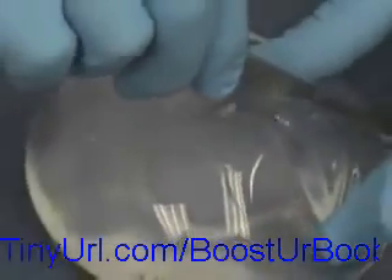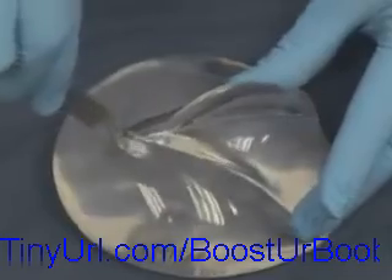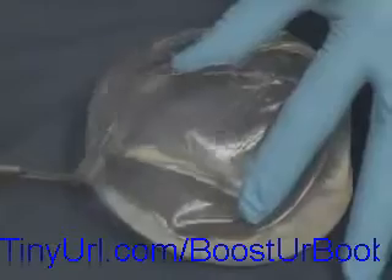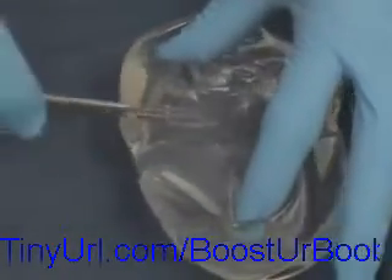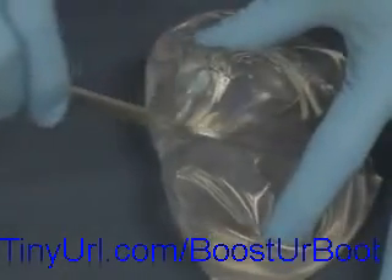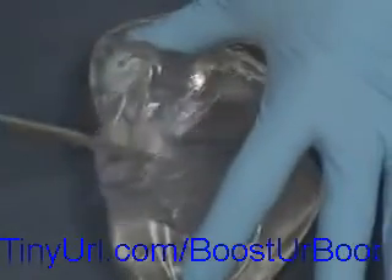Next, we're going to take the scalpel to this implant and actually cut it in half. Starting over here, we'll cut this entirely and see what happens with the Natural implant when it is cut in half. What you find is the material essentially stays within the shell, connected to itself — and it's not so easy to cut in half.